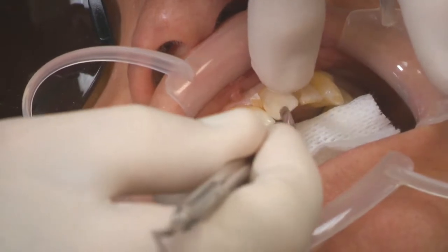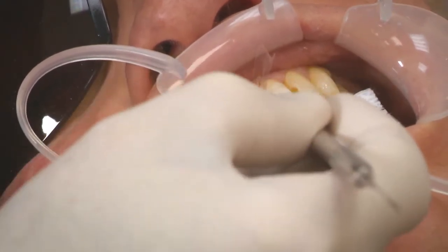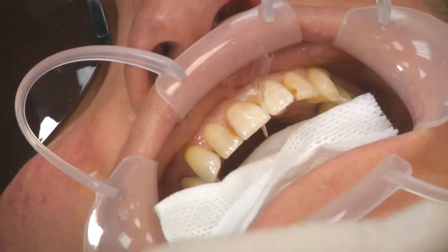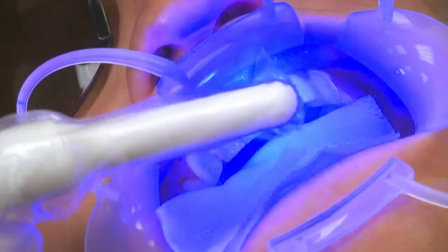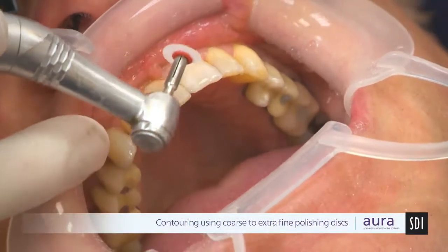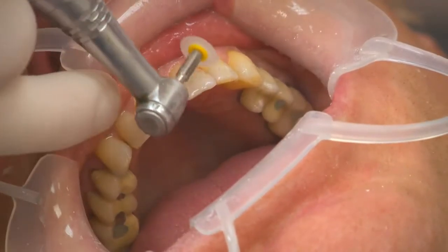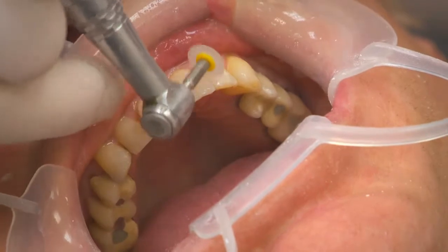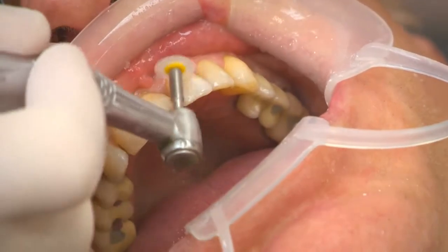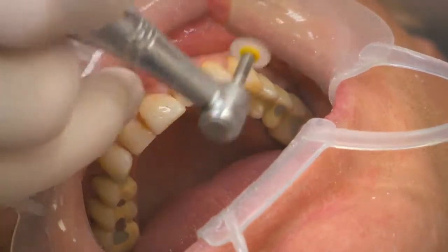We're going into our final stages of polishing, starting through our discs and then finishing with composite polishing. Take your time going through the discs, allowing the aluminium oxide to bring the composite up to ideal polish. Remember that the enamel is a microfill — 0.04 micron particle size — which will polish up to an incredible lustre.